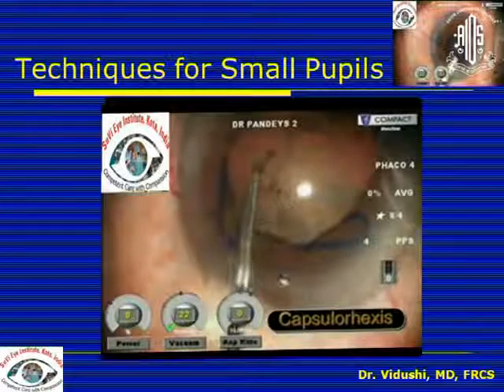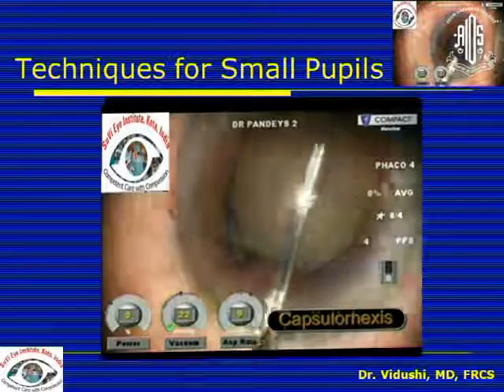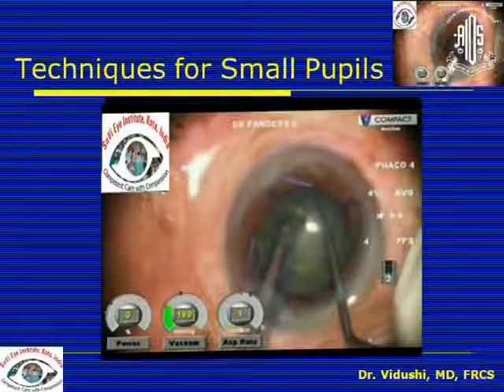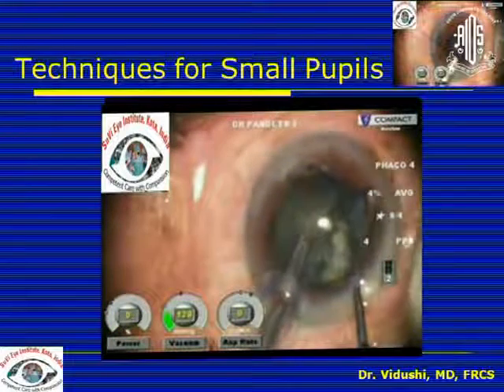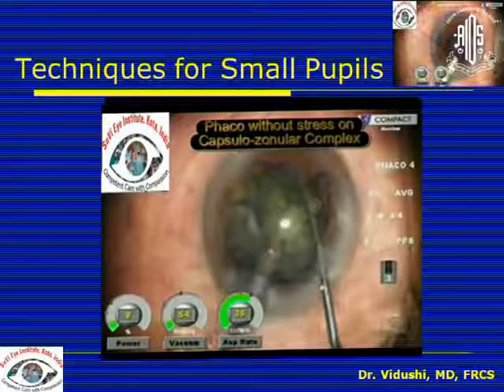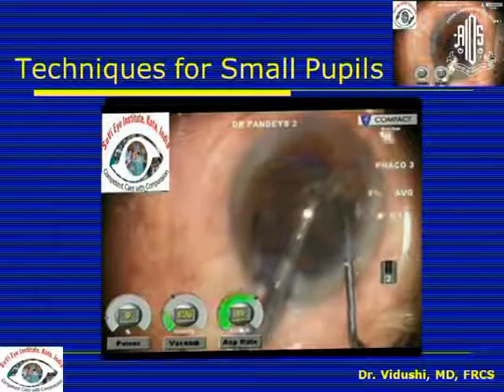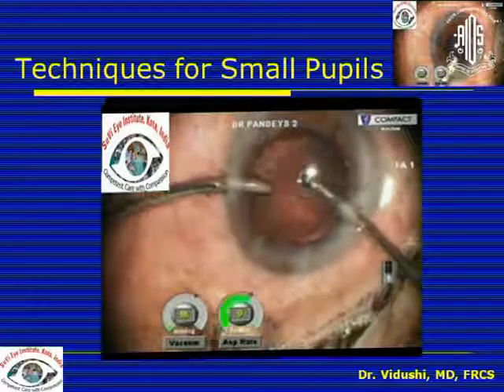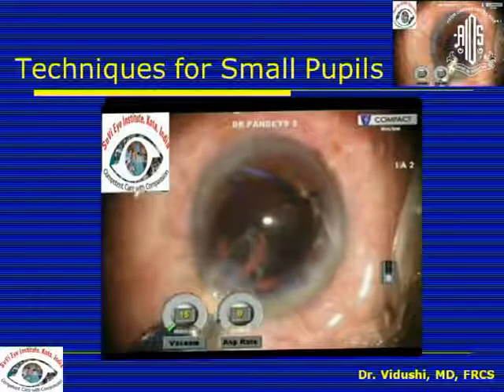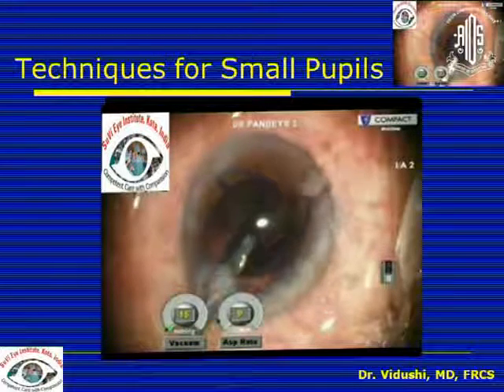Once you have this pupillary dilatation you can do FACO emulsification exactly as in any routine case. Always be very careful not to place stress on the zonules, because the surgery is already compromised and any problem with the zonules will be very difficult to manage. In all these cases viscoelastic is used very generously, so remove that viscoelastic at the end of the procedure.